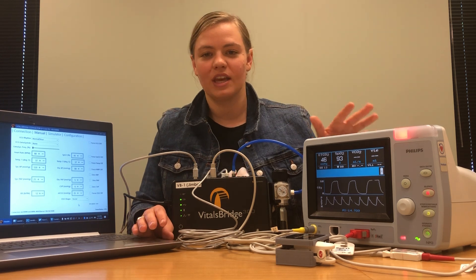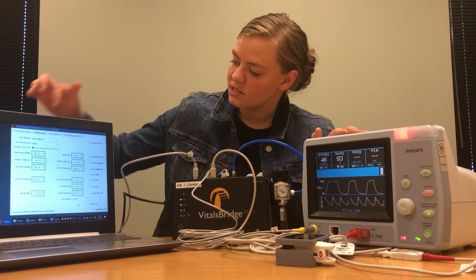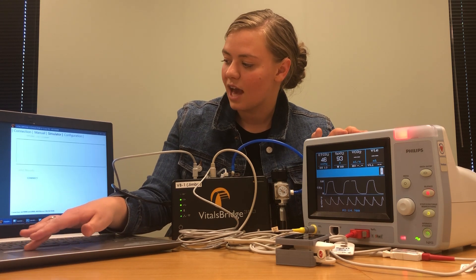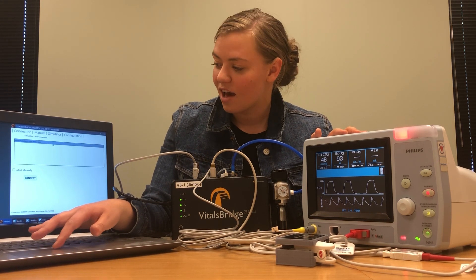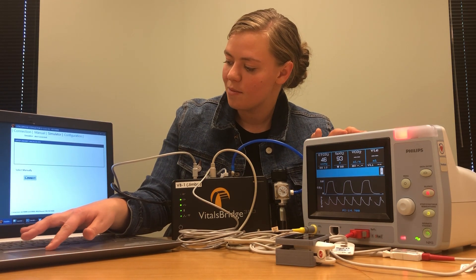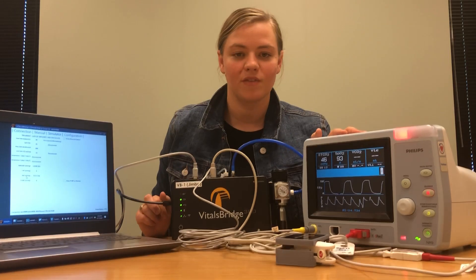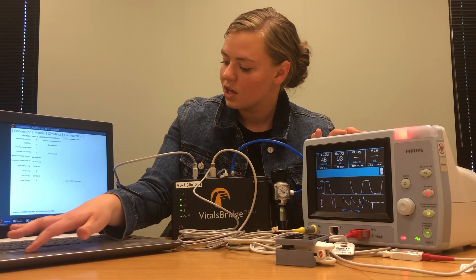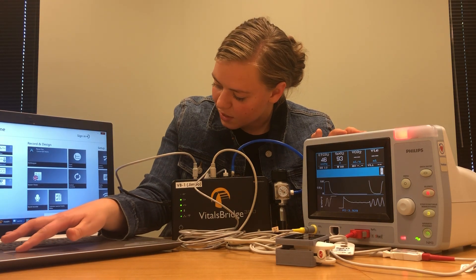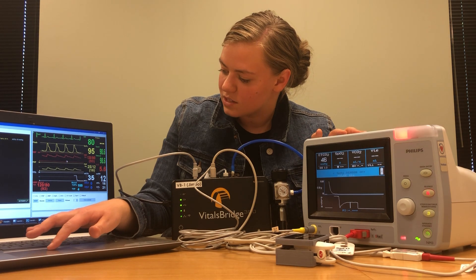If you'd like to control any of your vital signs on your monitor from a simulator, come here to the simulator tab of your VitalsBridge connector software — any simulators you currently have running will appear in this box. I have one running on my laptop, and I can connect to that by clicking 'Laptop' and 'Connect.' Once it's successfully connected, we'll be able to see all the vital signs coming in from the software. To control the VitalsBridge from the software, come to the simulator and you can control each of the vital signs there.